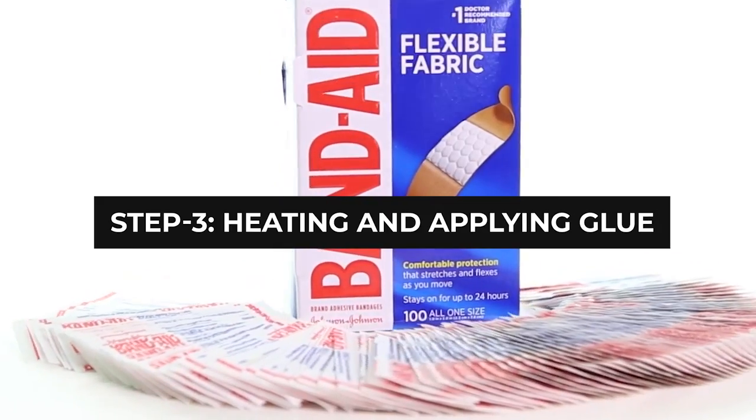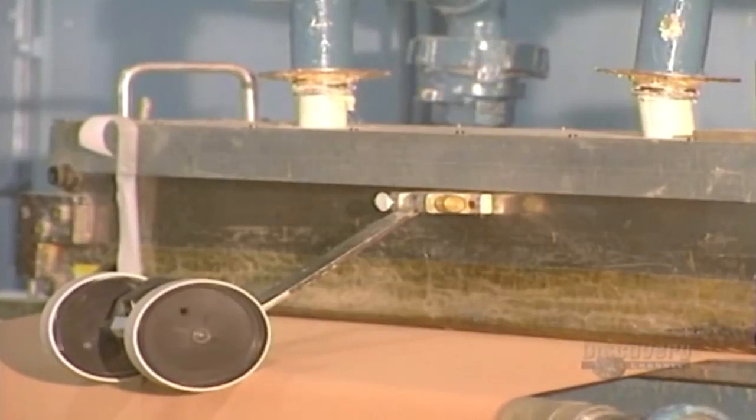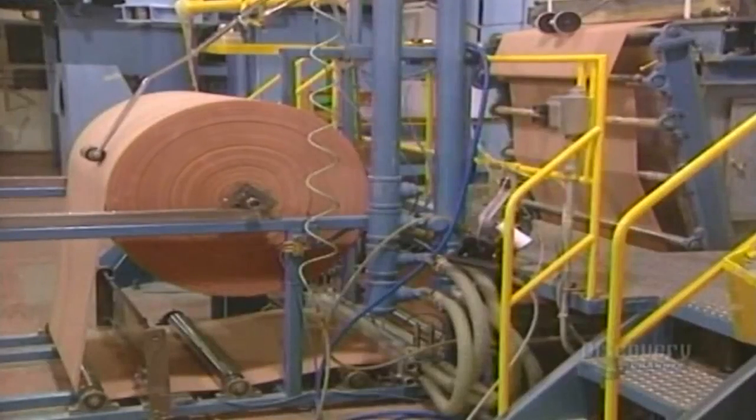Step 3: Heating and Applying Glue. A thin glue coating will be applied on the fabric surface. Then the material will be heated roughly to 49 degrees Celsius in an oven to puff it up. This will create holes in the glue coating.